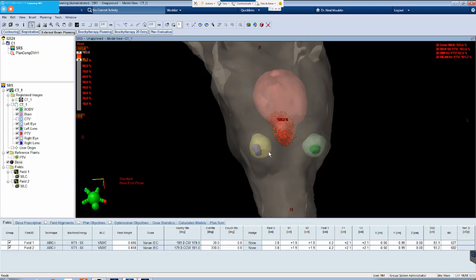And that's really the strength of stereotactic radiosurgery, especially when it's delivered as arcs, in that we get the best of both worlds. We're able to finely target the tumor and push a large dose of radiation into our target volume, while simultaneously sparing the normal critical structures that are oftentimes surrounding the tumor and making it difficult for us to treat effectively.